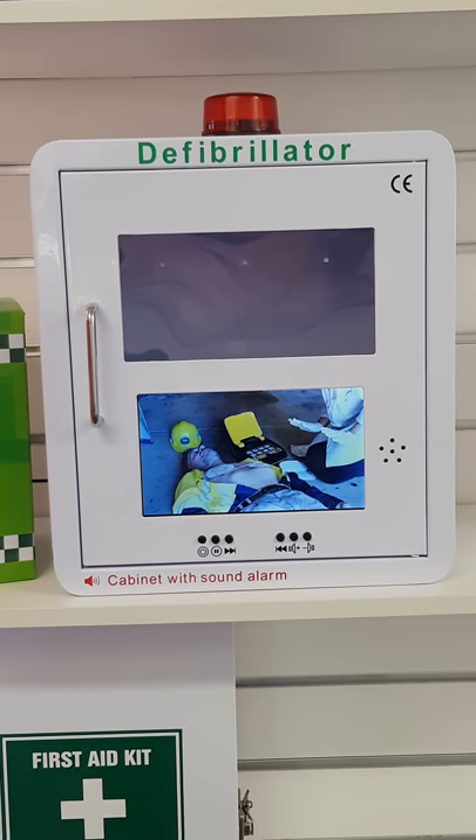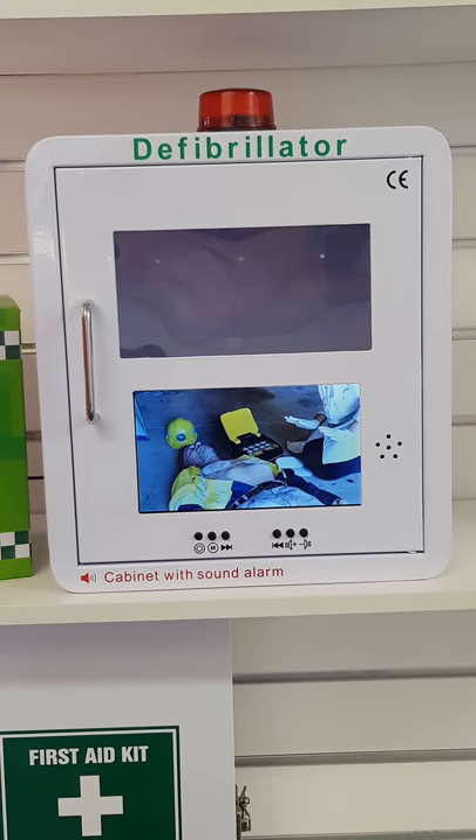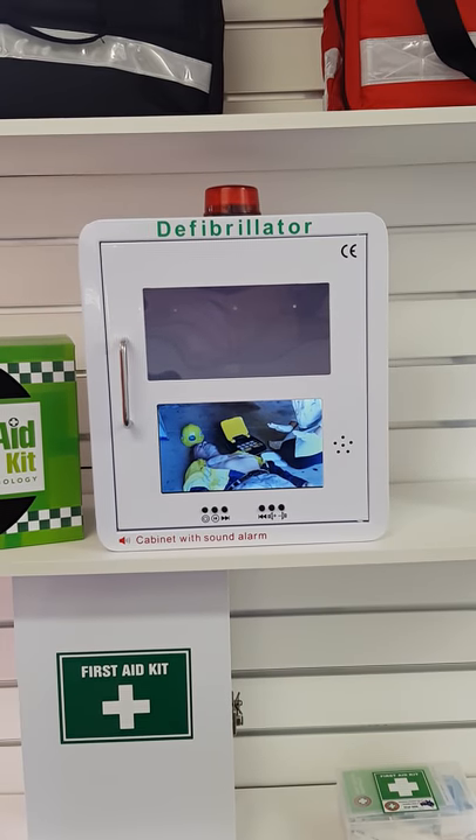Analyzing heart rhythm. Do not touch the patient. Shock advised. Charging. Do not touch the patient.